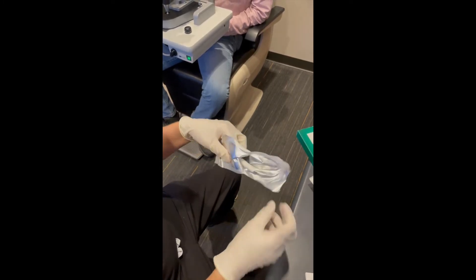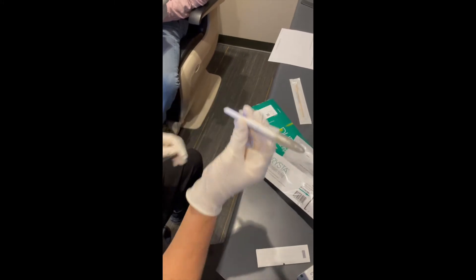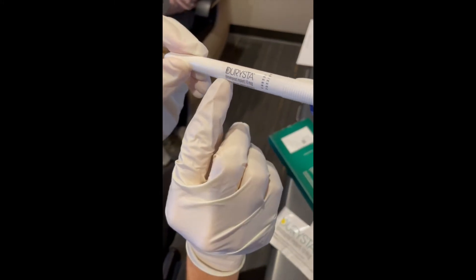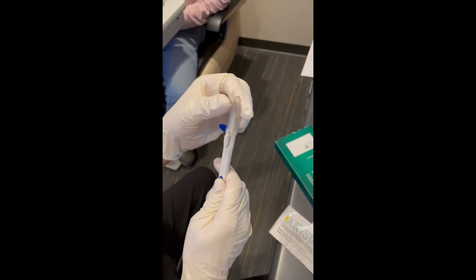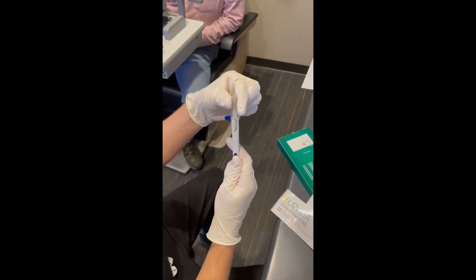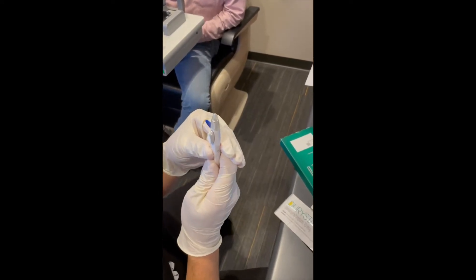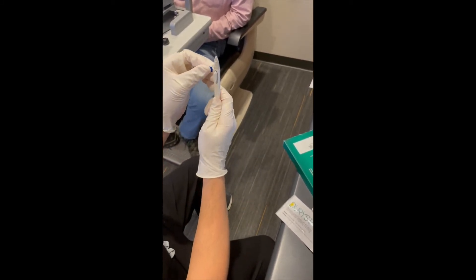So at this point you want to be very careful. I grab the back end of it here. The first thing that I do is inspect it and make sure that it looks good. It says Darista, Bimatoprost, 10 micrograms, made by Allergan. Then I take the first safety tab off — there are two. Next, I inspect the tip just to make sure that it's nice and sharp, then take off the second safety tab.